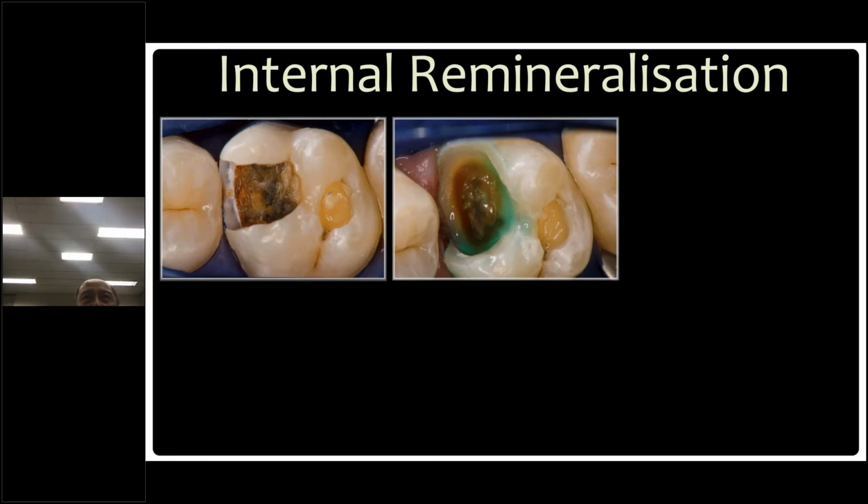I use that burr to create a very sound dentin margin and enamel. What I leave behind here is not important as long as I can achieve this band of sound dentin and sound enamel, because this whole principle works when you can actually seal the cavity.